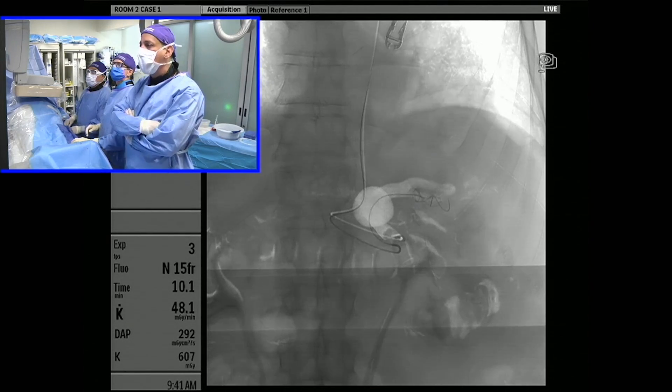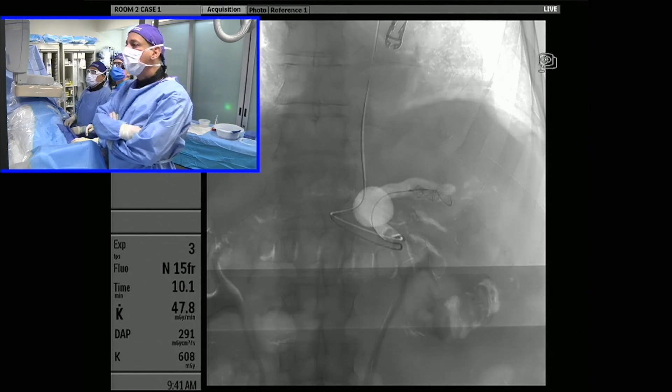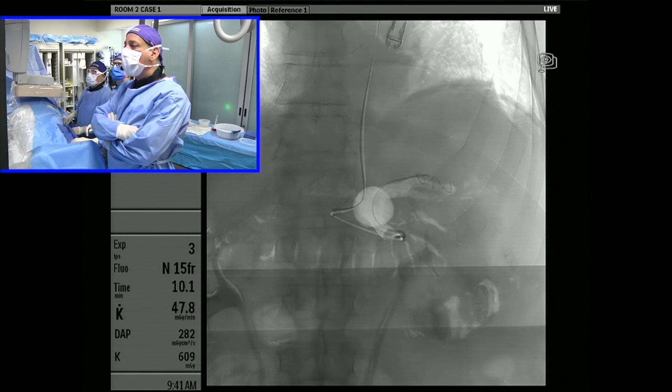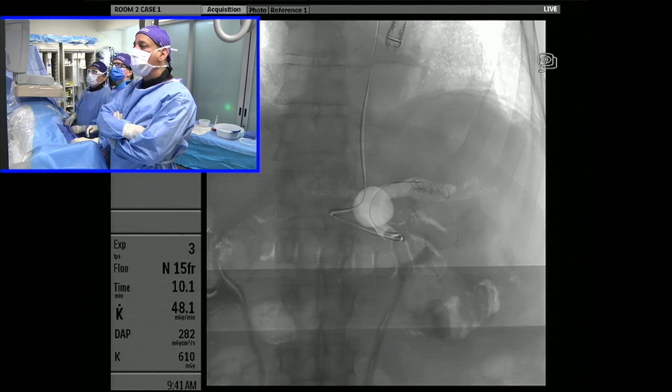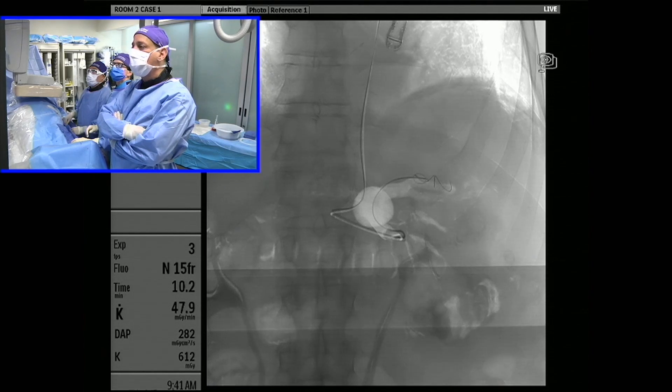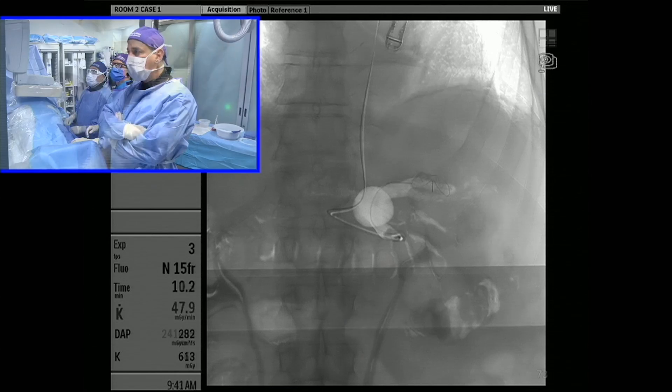It prolapsed a little bit, so we're just going to work with this for a couple of minutes until we can really get it to seed nicely right at that bifurcation area.